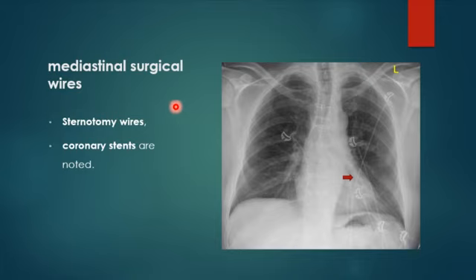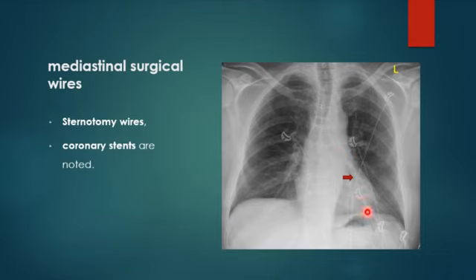This patient has mediastinal surgical wires and two radiopaque lines at the site of the left anterior descending artery through the interventricular groove — these are coronary stents.